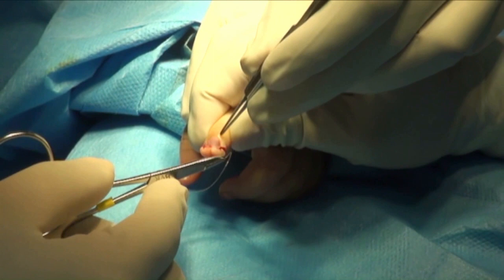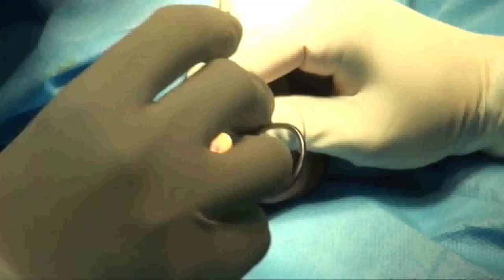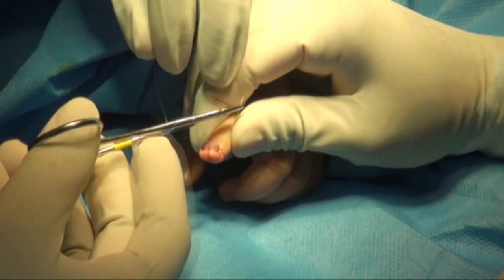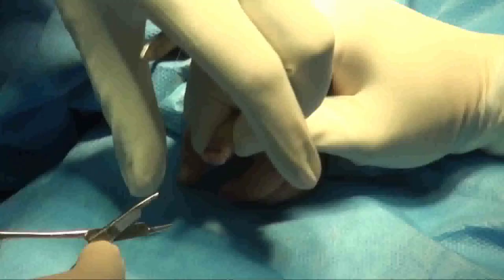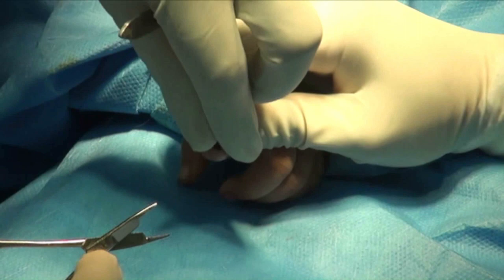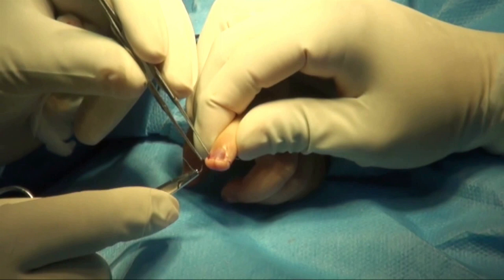A case of fingertip injury in a child. A proximally based flap is being sutured back to its stump using the type 2 needle holder this time. My hand rests on a stable surface in the surgical field whenever the support is required. Please note that my index finger supports the delicate flap tissues and guides the needle with precision.